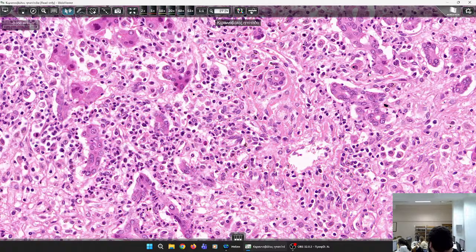Professor, is this immune mediated? In the specific case, at this stage, when you have such massive necrosis, you cannot easily say. But viral hepatitis very, very rarely causes this hyperactivation of the immune system. It is an exceptional phenomenon. The rule is that the organism sends the virus away. There is a very small subset of acute Hep B infections that can cause massive liver damage like this. Very few exceptions. This is not the rule.